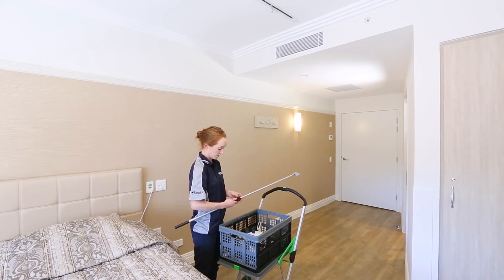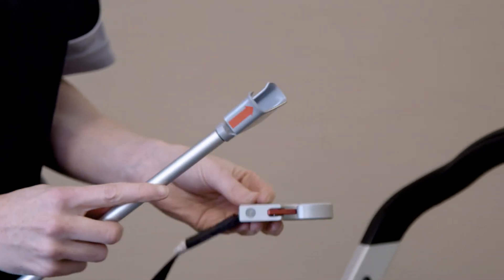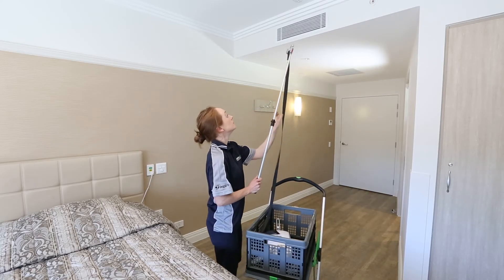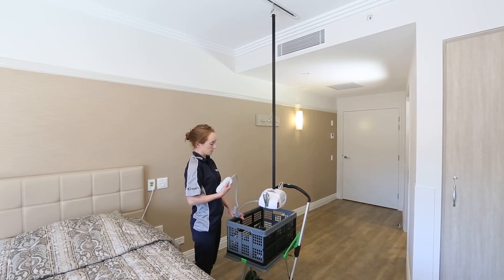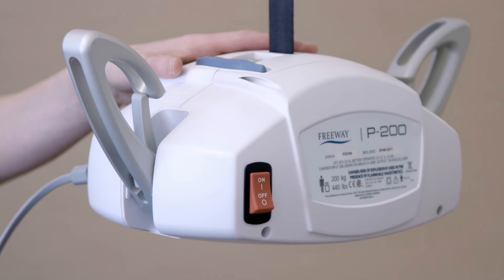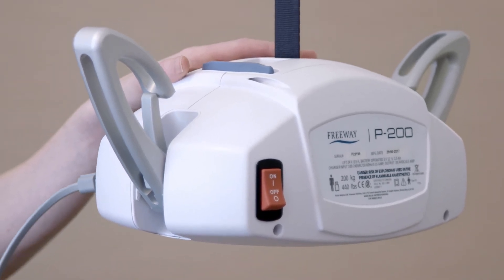Attaching the P200 to the ceiling track is easily done without the need for manual lifting. Simply attach the reacher bar to the QRS hook, leaving the hoist in its transport cart with the lift tape slack. Hook the reacher bar onto the ceiling track trolley and press the UP button on the hand control, ensuring that there are no twists in the lift tape as this can damage the motor. The hoist is now attached to the ceiling track without the need for any manual handling effort.